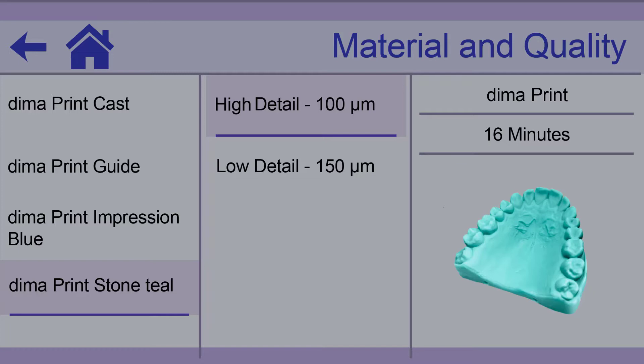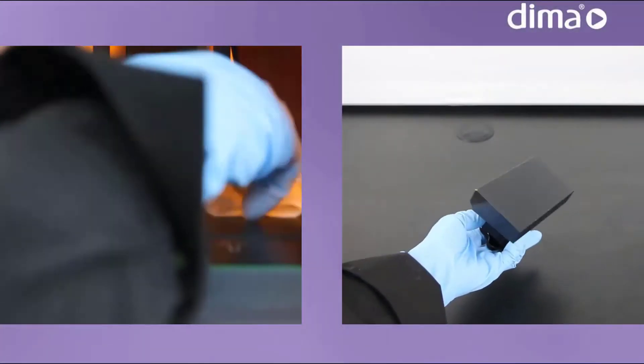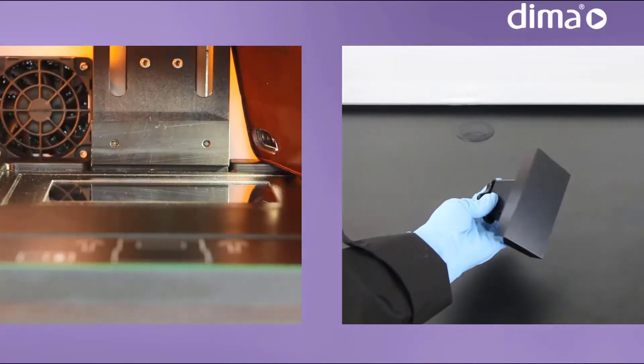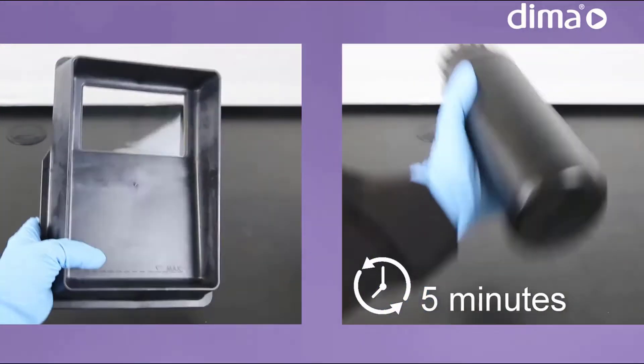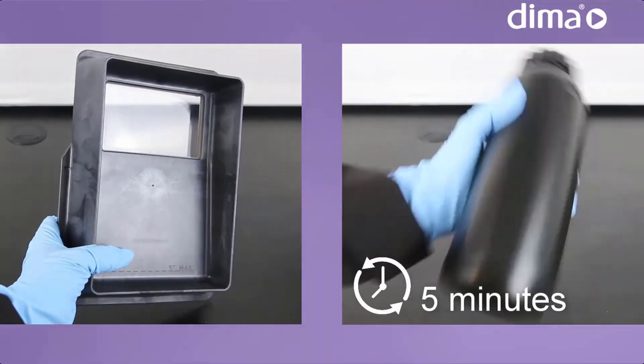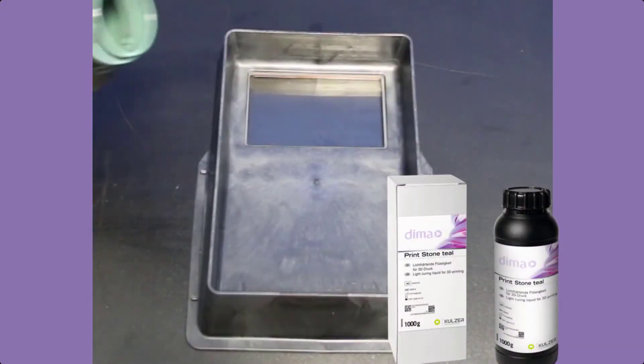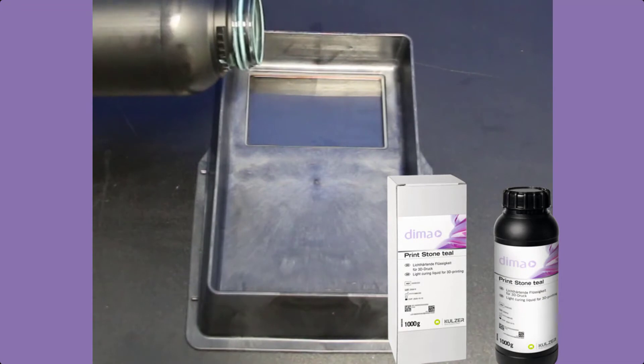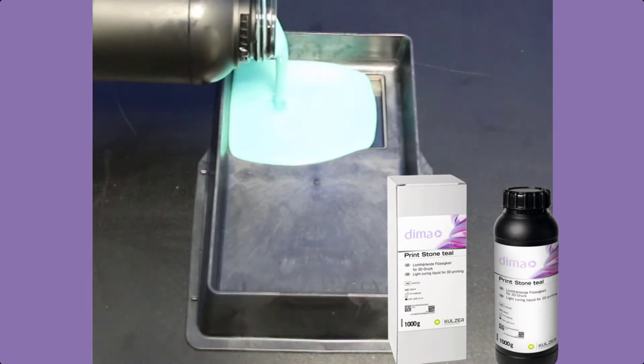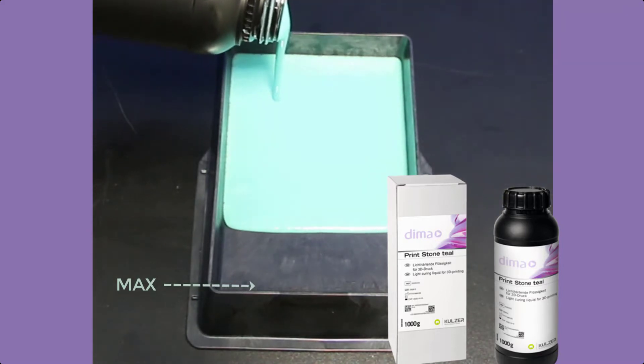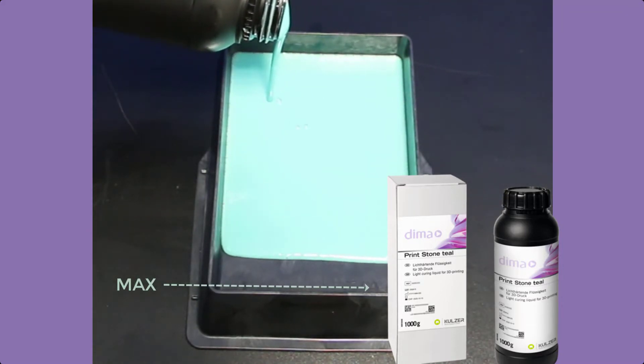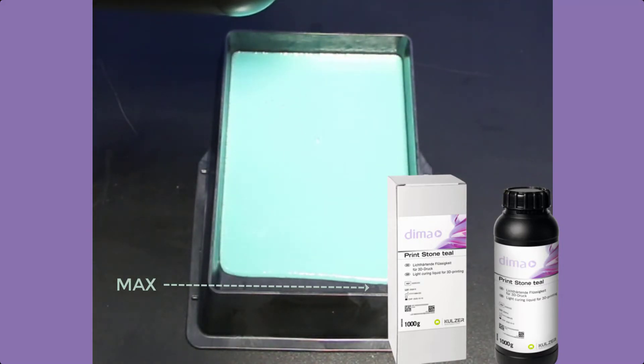After you have checked the printing area inside the printer, the material tray, and the printing platform for cleanliness and have shaken the material for five minutes, fill it into the tray. Always fill the tray to the maximum line. This way you avoid bubbles in the print and prevent running out of material during printing.